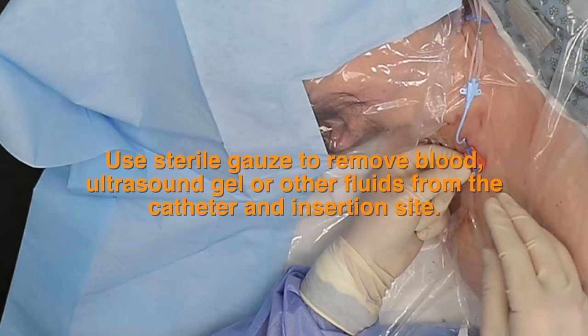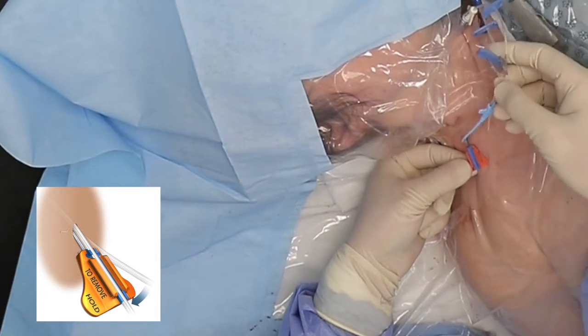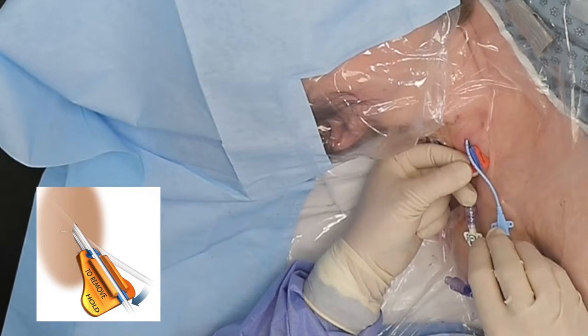Use sterile gauze to remove blood, ultrasound gel, or other fluids from the catheter and insertion site. Align the catheter with the groove in the base, making sure the catheter shaft and SecuraCath base are dry.